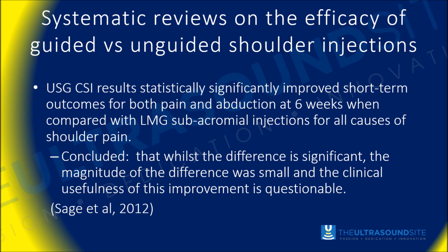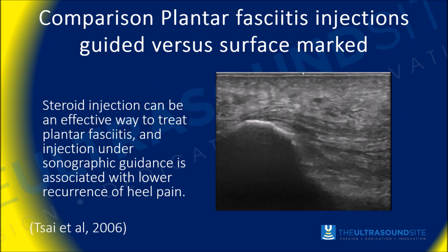Obviously, there's a big training delay to build up the number of clinicians that would be available to perform these. So the training time is quite significant, and therefore it's not something that can suddenly be introduced overnight. A bigger task force is needed for dealing with the unmet need of ultrasound guided injections. So again, another article by Sage et al. concluded that whilst there was a difference, the difference was relatively small, and therefore questionable whether or not it justified putting all patients through an ultrasound guided injection pathway.